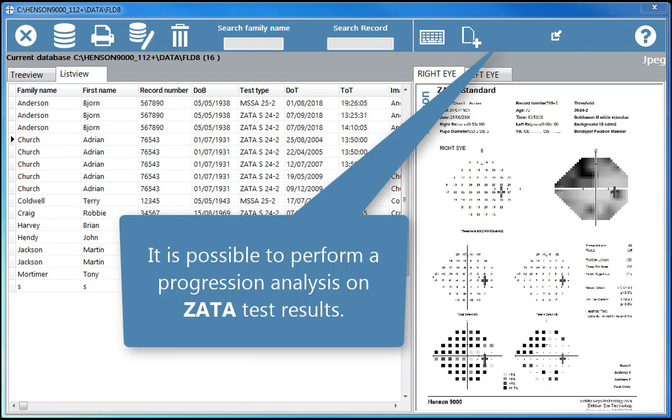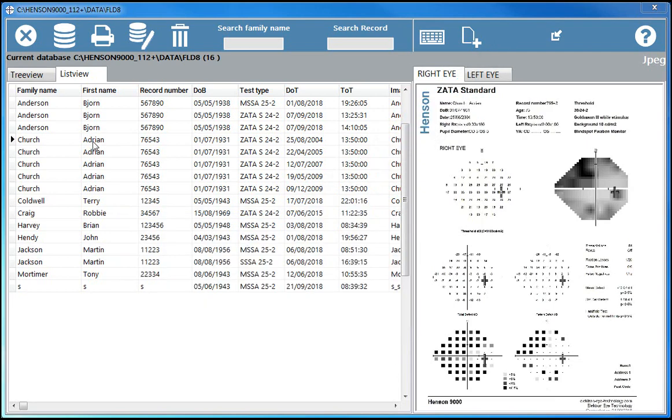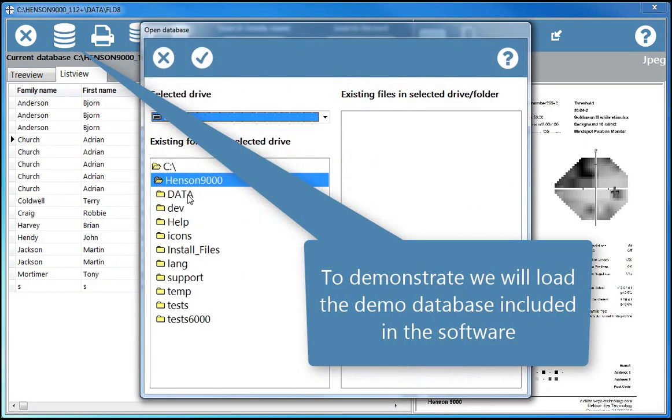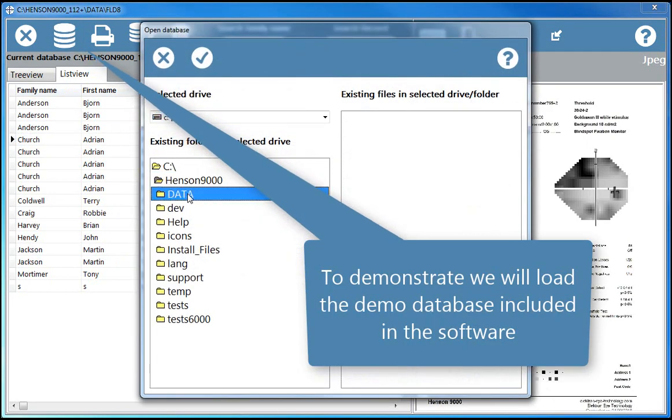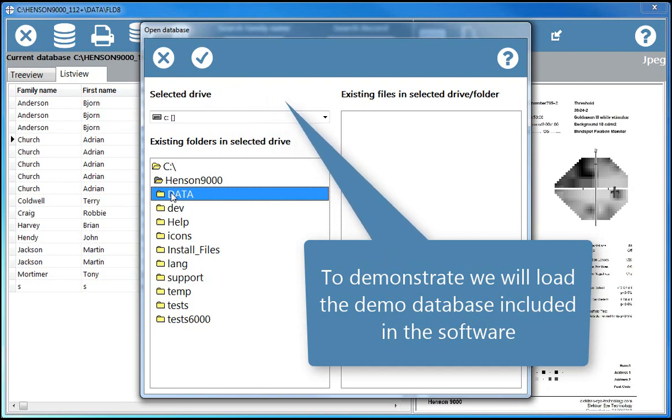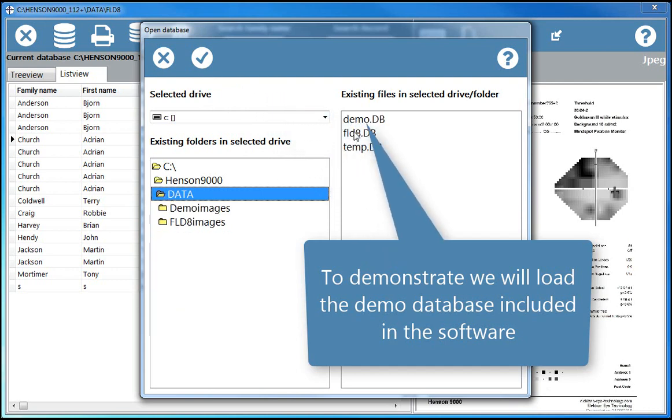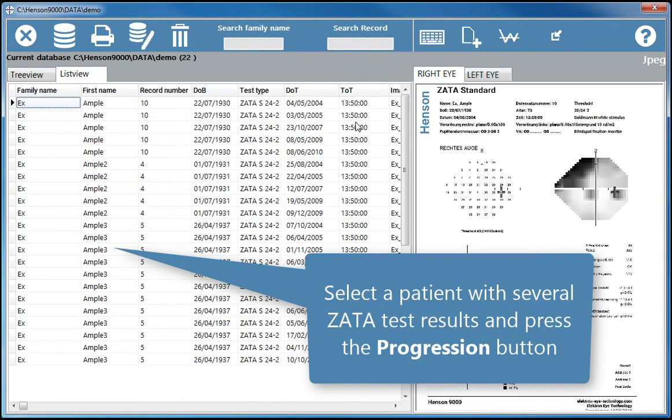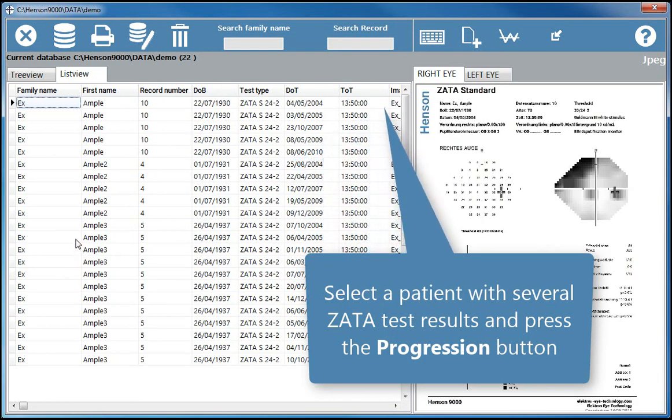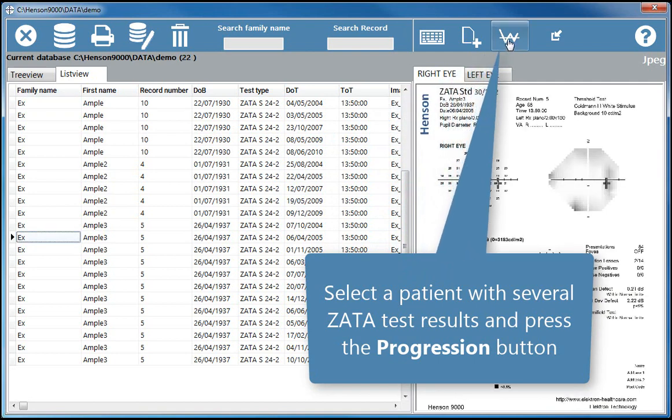It is possible to perform a progression analysis on Zata test results. To demonstrate, we will load the demo database included in the software. Select a patient with several Zata test results and press the progression button.